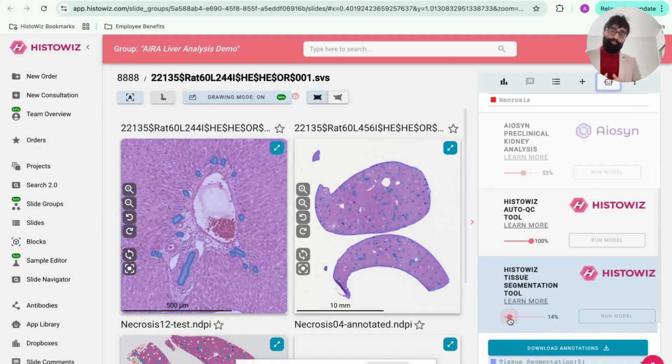You can cross play across these multiple apps simultaneously. Again, this is just an example scenario. Another example would be, say you're interested in cell segmentation or percentage biomarker quantification from QuPath, and you're interested in AIRA Matrix analysis. So you can load in these results simultaneously and look for the result.